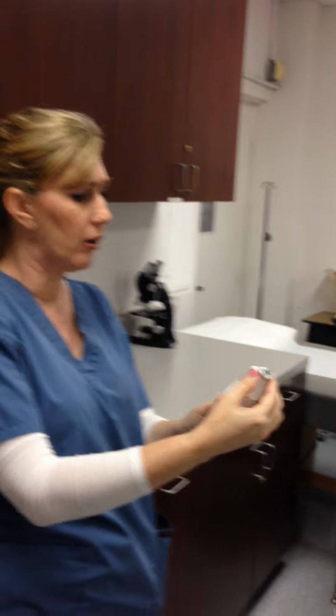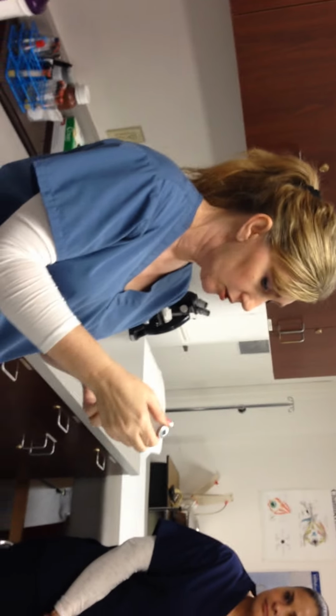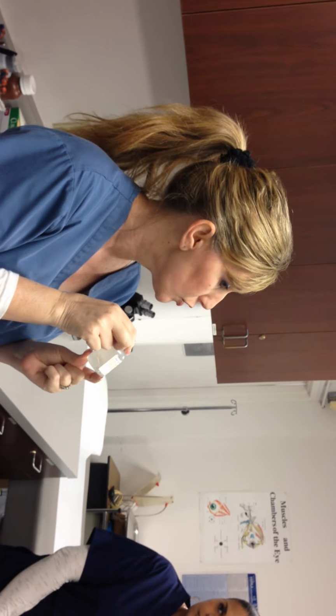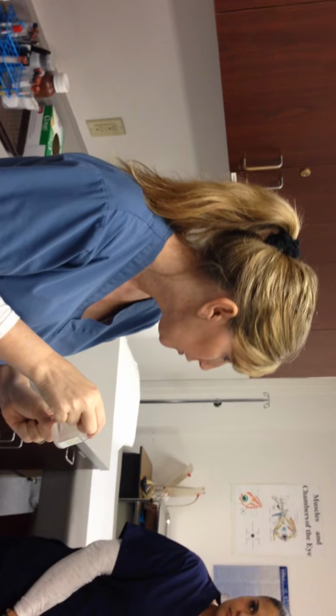So you're looking at your vial. Yep, there it is, blah, blah, blah medication. So-and-so amount, 250 milligrams. You're going to look on here and make sure, right? The other thing that you're looking for is on here, it's going to say a lot number. L-O-T is the lot number. So this tells you where it was manufactured, when it was manufactured, what company manufactured it.